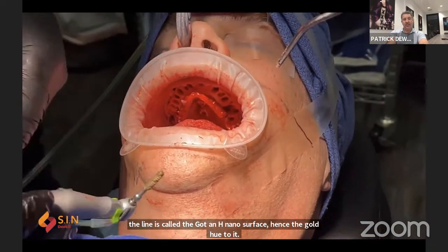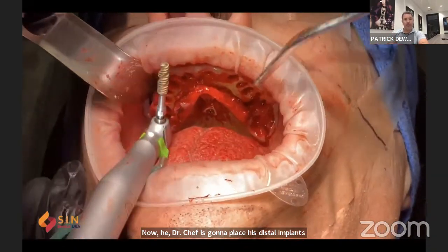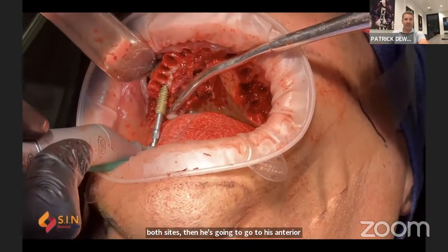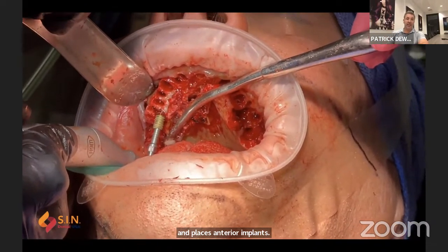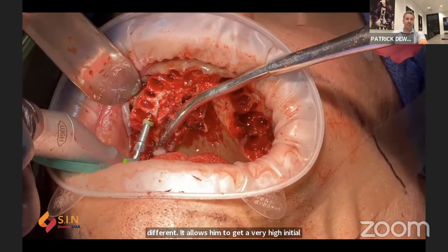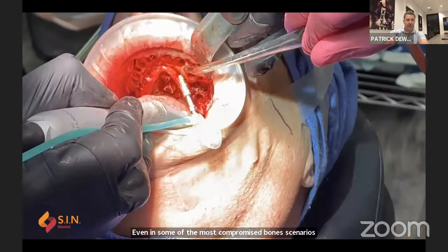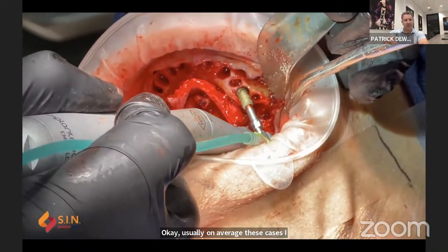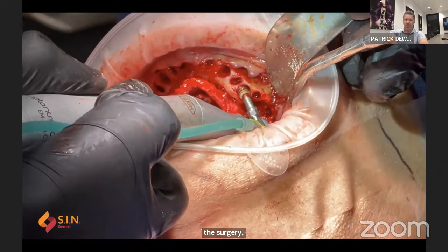Now Dr. Sheth is going to place his distal implants first to make sure they get high initial stability in both sites. Then he's going to go to his anterior sites and place his anterior implants. Now you notice the thread pattern on these is very different. It allows him to get a very high initial stability, even in some of the most compromised bone scenarios. Usually on average, in these cases, I think in this surgery, they were around 70 to 80 Newton centimeters of torque, which is more than acceptable for a single implant site.